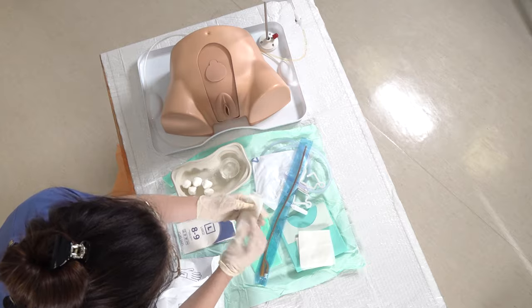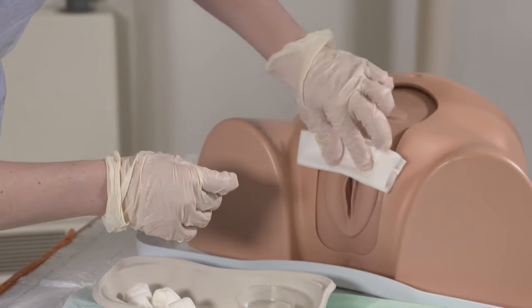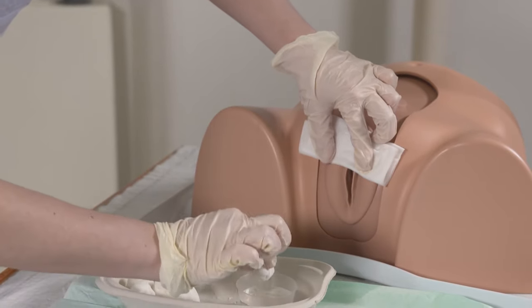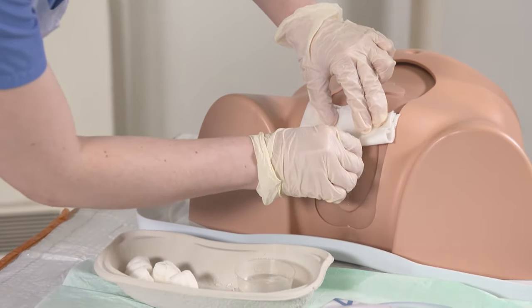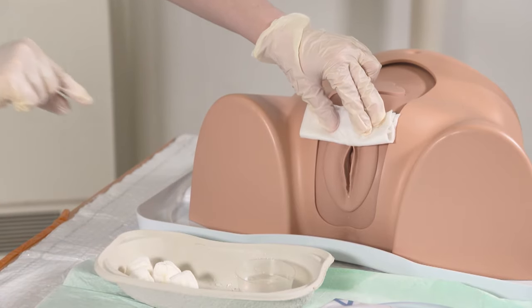So now we're ready to clean the area. Using a bit of sterile gauze to hold the labia minora apart, put some cotton wool balls with some normal saline in your galley pot, then you're going to clean the area in single downward strokes, placing the cotton wool in the bin each time.